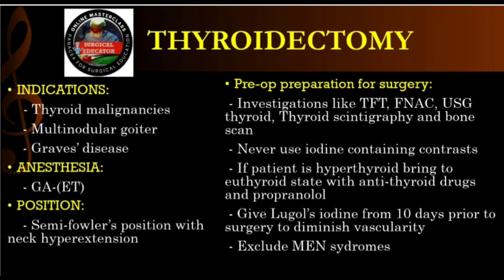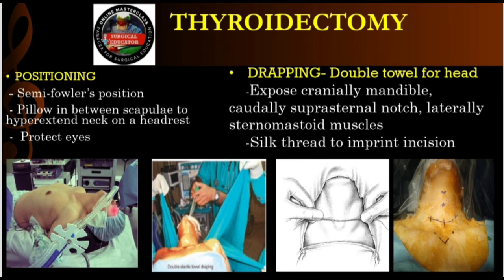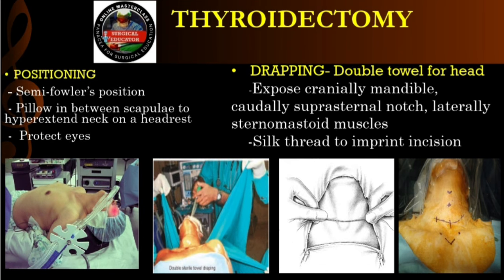Okay, moving on to slides 4 and 5. The patient is optimized, airway is secure. Now we look at positioning and draping. This is where the physical geometry of the operation starts. Right, the semi-Fowler's position. We place a firm pillow right between the scapulae, the shoulder blades, head on a ring to hyperextend the neck, and then we elevate the head of the bed 15 degrees.